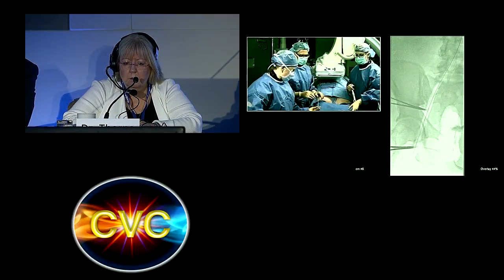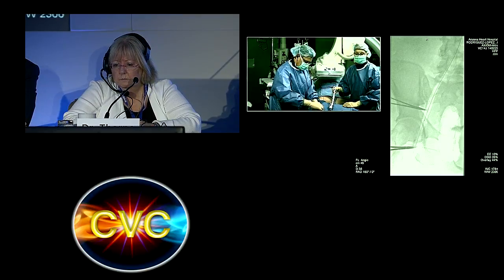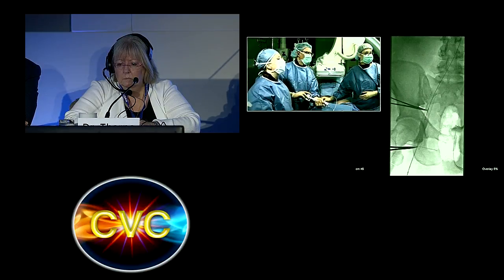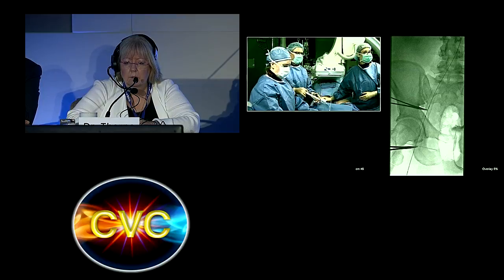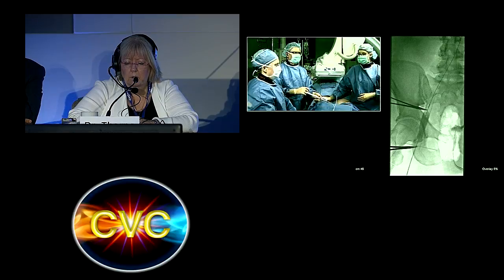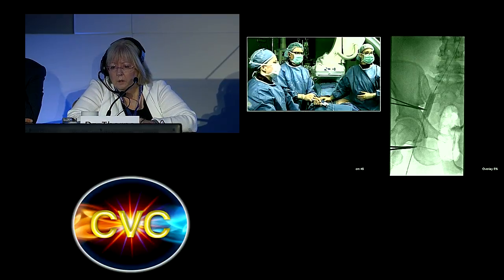All right, so we're going to concentrate right here on the main area of stenosis. It's very fibrotic, isn't it? Yeah, it does. You just use the shoulder here of this balloon. All right. I don't think there's going to be any problem in that position here, but I'm going to touch that just to expand it some more.